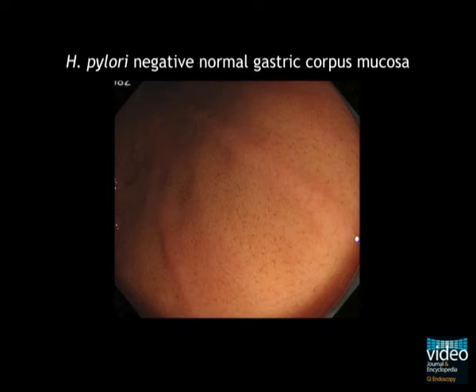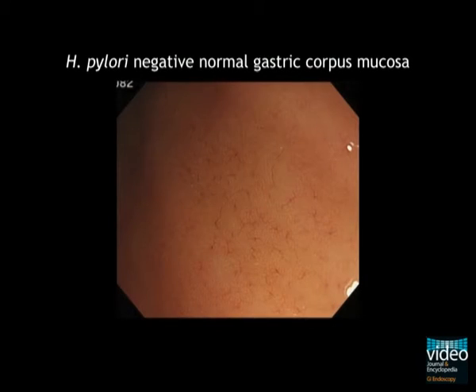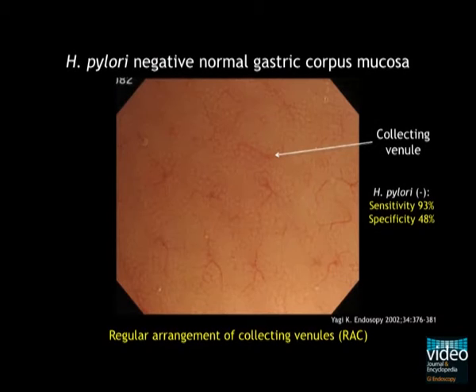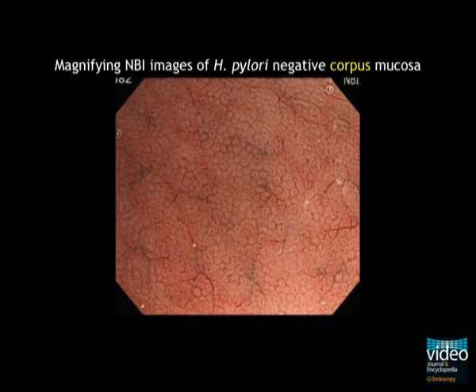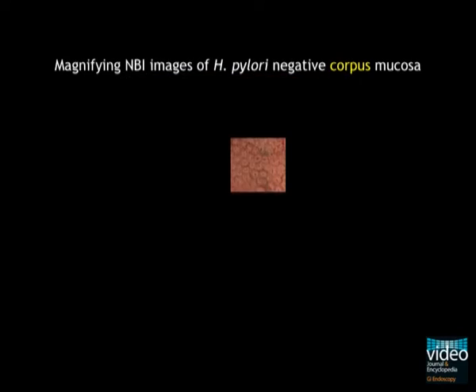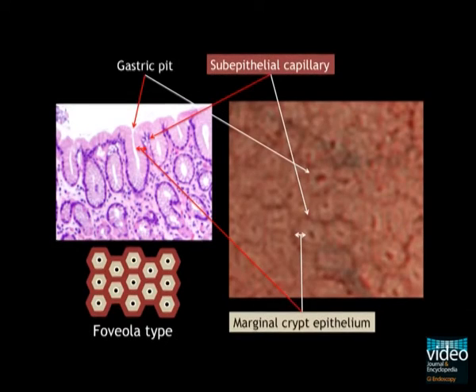Moreover, when magnifying observation is used, regularly arranged spider-like collecting venules can be observed. This finding is seen in more than 90% of H. pylori-negative patients. In the magnifying NBI image of the corpus mucosa, the round gastric pits can be seen and the light brownish epithelium are surrounded with a network of dark brownish capillaries.